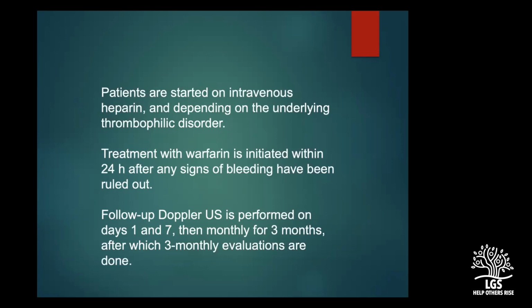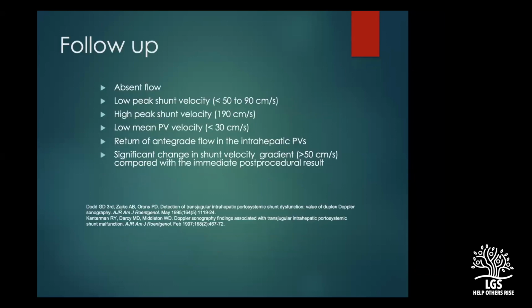And usually, the minimum that I would do is at least 3 months, of course, with a routine follow-up ultrasound every 2 weeks for the first 1 month, and later on every 3-monthly Doppler ultrasound to make sure that it is patent. As long as there is a regular screening, we don't have to worry about the patency of these stents, because the earlier we detect, we can definitely go in and unblock all these stents. The problem is if it goes undetected, if they don't come to us, when it's chronically thrombosed, that's when it becomes very difficult to treat them. But as long as they're under surveillance, as long as we screen them, I don't think we really need to worry about that. And this is how we do the follow-up, and that is for radiologists.